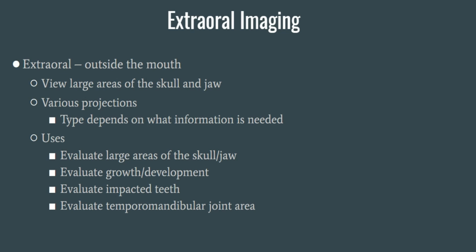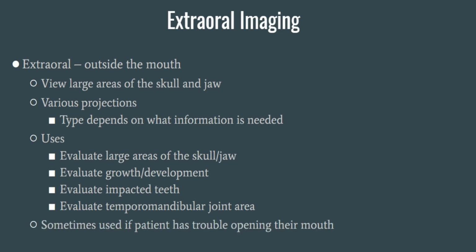Or in the case of some patients, if they have trouble opening their mouth, an extraoral film may not be the most diagnostic, but it will be the best option because at least you will have some view of what is going on with this patient's mouth. Now, as I just mentioned, it might not be the most diagnostic because with our extraoral imaging, some of our images are not as sharp or defined, so it renders it just a little bit more undiagnostic in certain situations, like for detecting caries. But otherwise, if our patient is having trouble opening, this may be our only option.